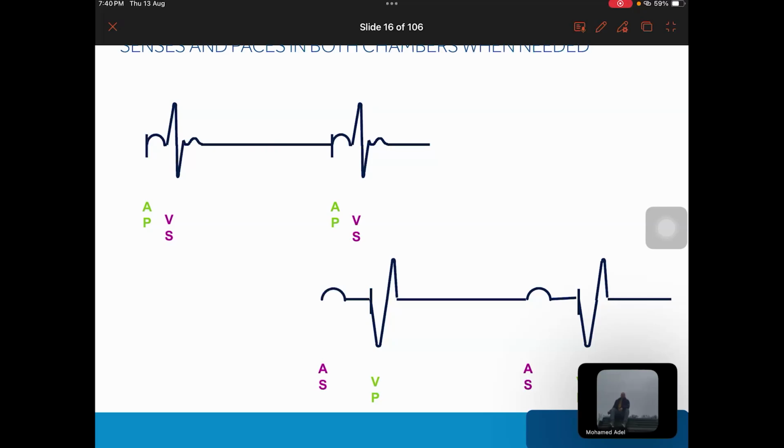This is in pacemaker timing. It is a brief, so you will understand it more, but in the timing it will depend on pause.